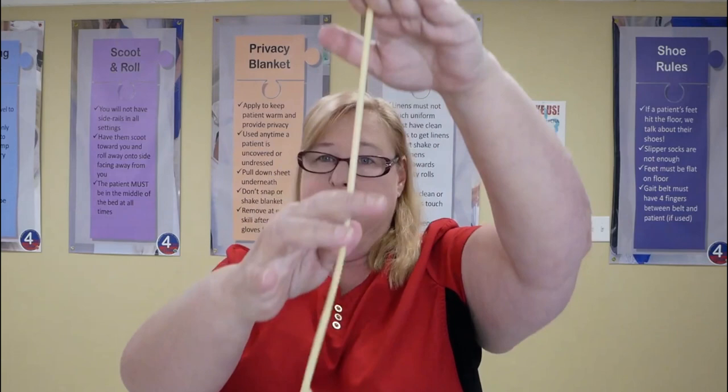So we have this part in the body, right? We have this tubing, and then we have a big hole here. All that's going to do is let the urine from the bladder come out onto everything. That's not going to help. So what we're going to do is connect this to a drainage system of some sort.